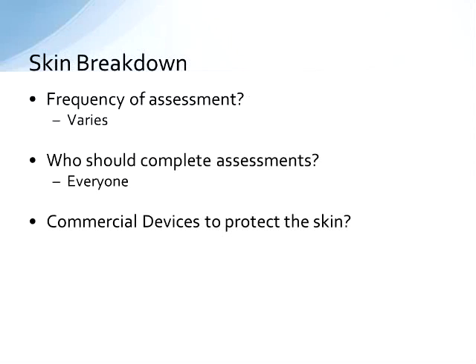So how frequently should you be looking at this? I think this varies by institution. At our institution, I would suggest that every single person, every single time they take off that mask or move the interface, they should be looking at the skin. And not just for clear breakdown. We really need to be looking for redness or blanching of the skin, and then you should take action. So we actually require our therapists to document even redness, even blanching. And when they document those things, we also require that they document the intervention they took to prevent the pressure ulcer from occurring at that point.